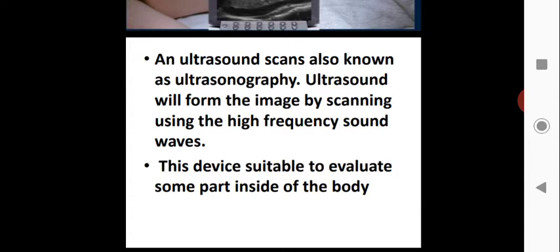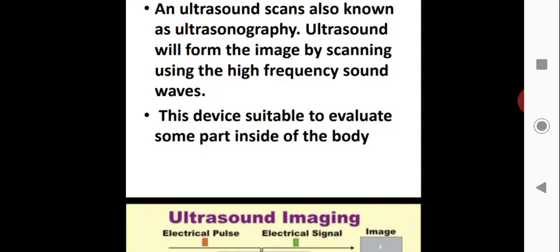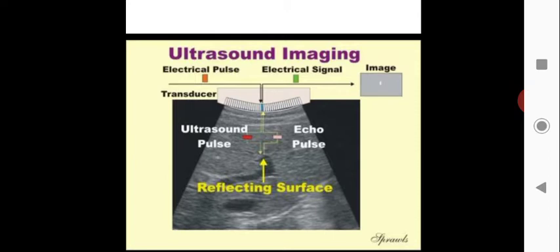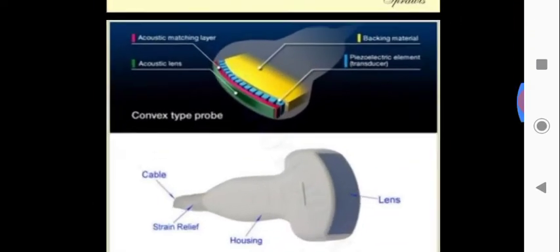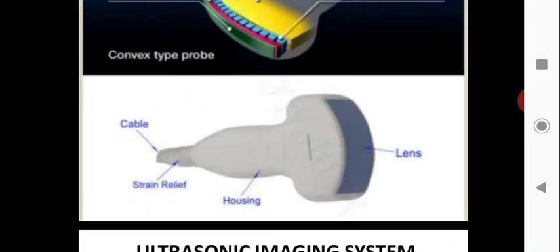This device is suitable to evaluate parts inside the body. You can see the ultrasound pulse, the reflecting surface, and the echo pulse being received. The device used for ultrasonic scanning has components including: acoustic matching layer, acoustic lens, backing layer material, piezoelectric element, cable strain relief housing, and lens.